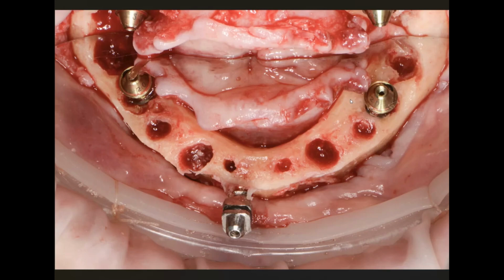Or if you did this the way that was shown to me by that group out west, the fiducial would be in the canine, it would be completely in the way. I'd have a big, giant, elevated ledge of bone and a root there still to deal with, and that would get in my way of the tilt of the anterior implant. So you see that with my technique, everything is out of the way.